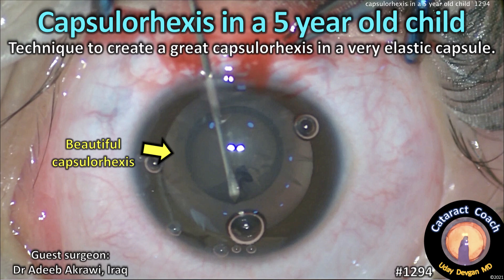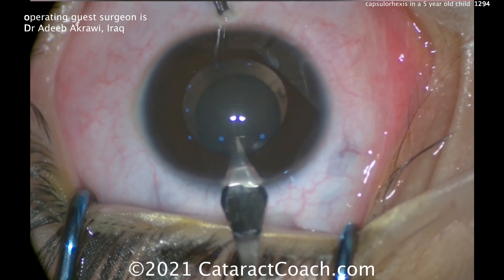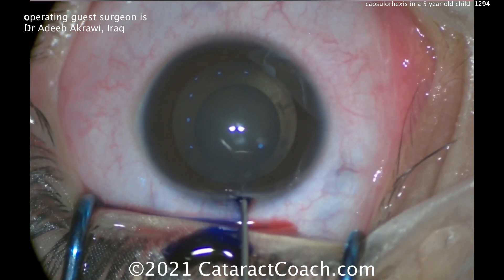cataractcoach.com — capsule rexis in a 5-year-old child. Here's a technique to create a great capsule rexis in a very elastic capsule. This is Dr. Adib Akrawi from Iraq.